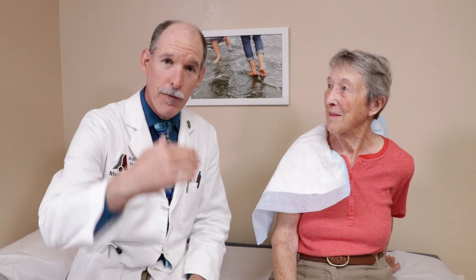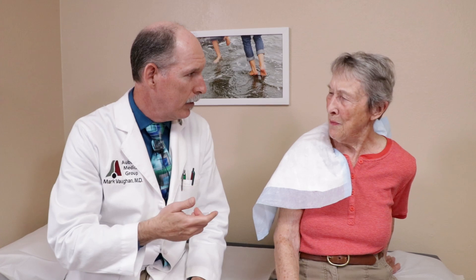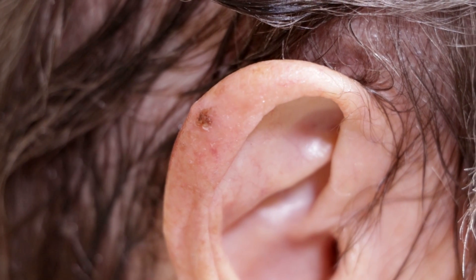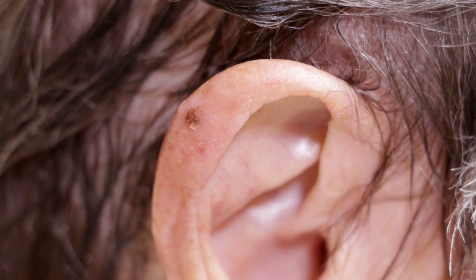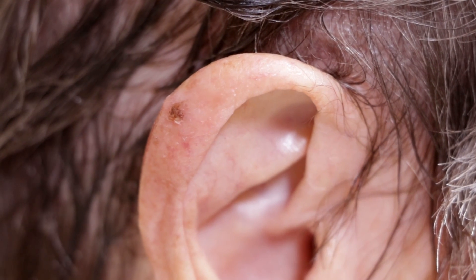Hey Kay, thanks for joining us for Kay's biopsy. You've had this lesion on your ear for about two months. You can kind of feel it and it's got irregular color to it. So we do need to take it off and make sure it's not a type of skin cancer, because they like to show up on people's ears.